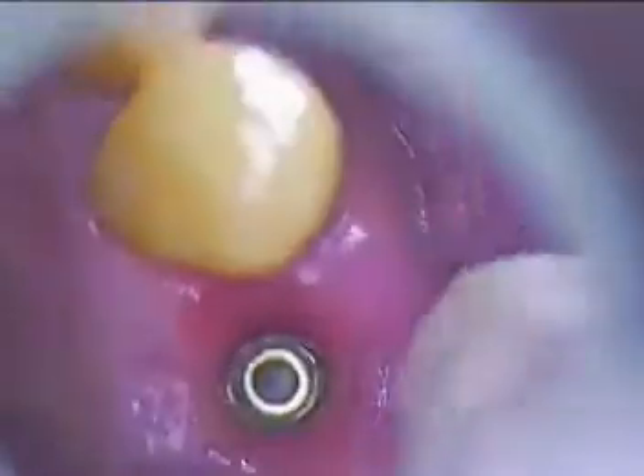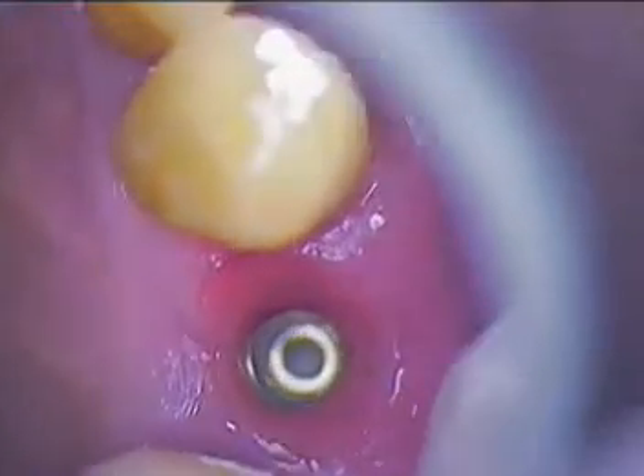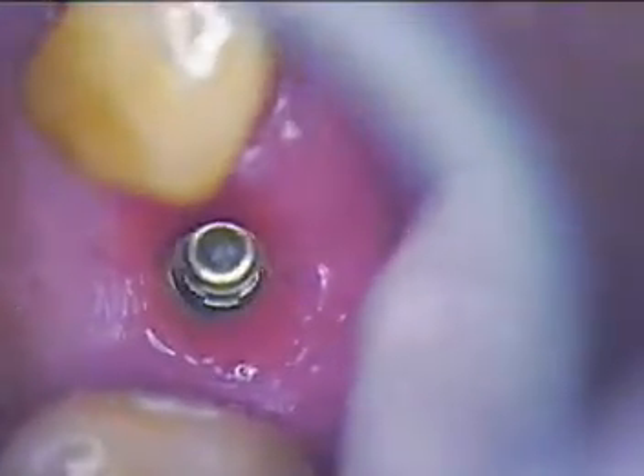It's been at least a couple of weeks, so we're going to take a first-hand look at what that tissue looks like. It looks a lot better than what it did in the past — you can still see a little epithelium but no bleeding, and that looks like a nice adaptation.